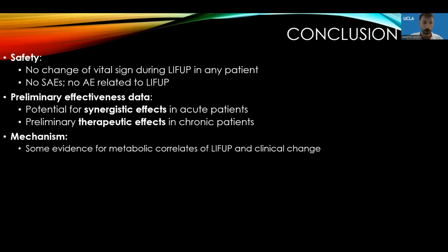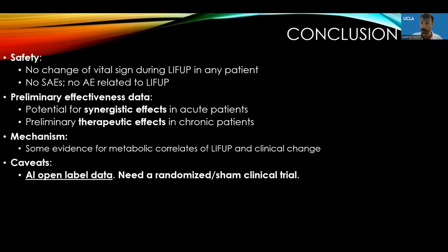Of course, I have to stress this is all done open label. So our next step, once we have completed data acquisition for this clinical trial, is definitely a randomized, double-blind, sham-controlled clinical trial so that we can really start looking at these effect sizes.